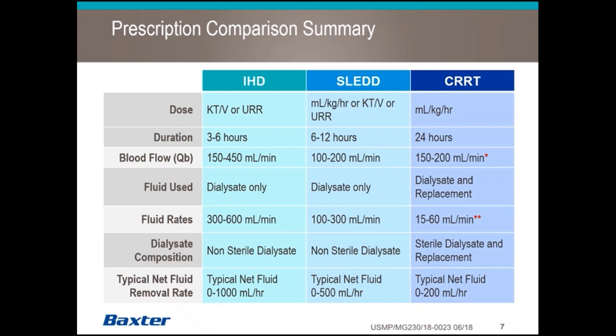Blood enters the filter through hollow fibers. The dialysate is infused on the outside or bathes those hollow fibers, and the blood and dialysate never touch. Because of this, the dialysate solution does not have to be sterile and is considered a medical device. In the world of CRRT, we use sterile dialysate solutions. It still functions as dialysate should, in that it doesn't touch the bloodstream, but for safety and other reasons, only sterile dialysate is generally used in CRRT treatments.